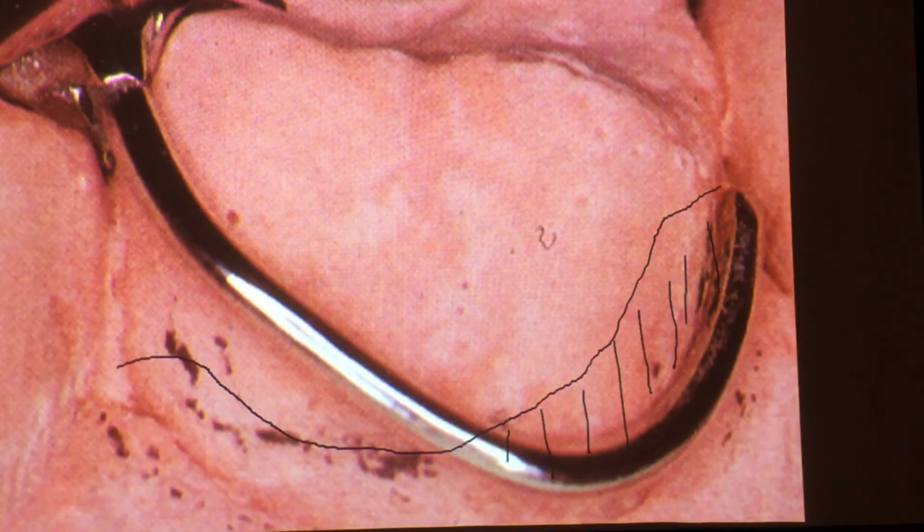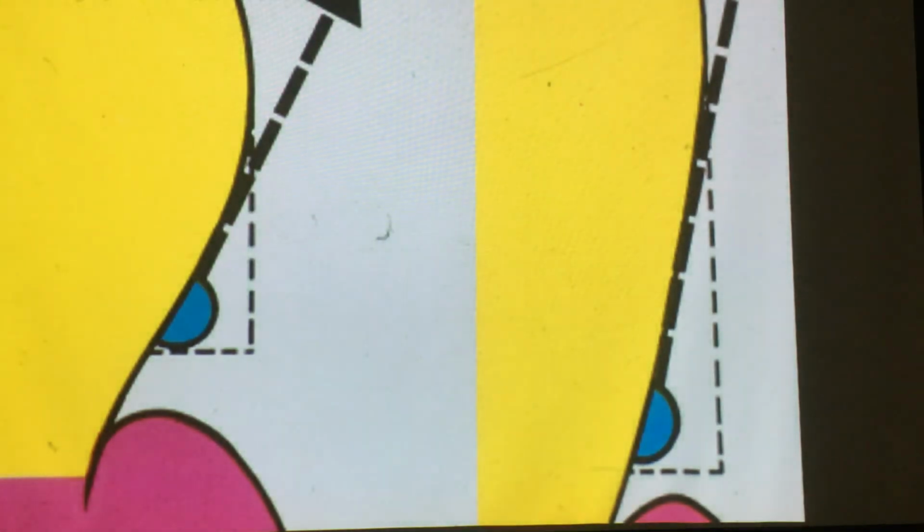So this is really important that we make cast partial dentures that fit somewhat passively, but yes, retentive. How much retentive? Not just enough, exactly enough. 0.25 millimeters into the undercut of that abutment tooth. Now, the depth on the tooth doesn't really matter. It all depends on the shape of the tooth. So you can see here, this is from Davenport's textbook, picture number 1 on the left, where we have the height of contour similar to the one on the right, but the throw of the clasp, or the length that it has to travel to dislodge. These arrows are the path of dislodgement. How long does that clasp have to travel along the buccal surface of the abutment tooth before it's dislodged off the tooth, depending on the shape of the tooth.